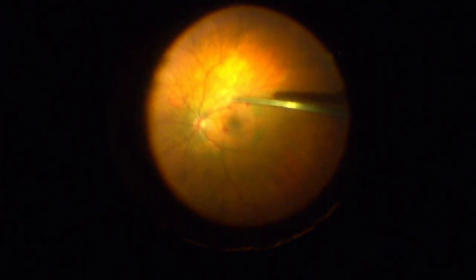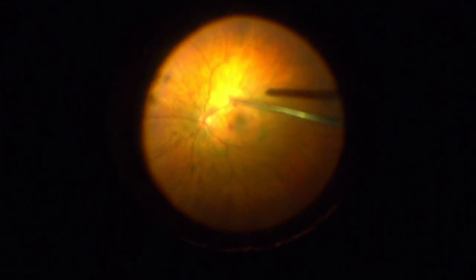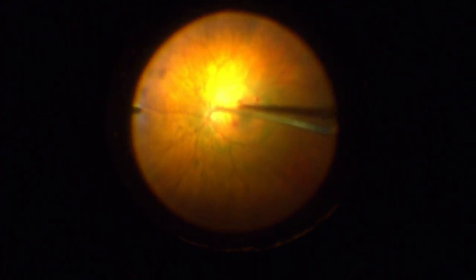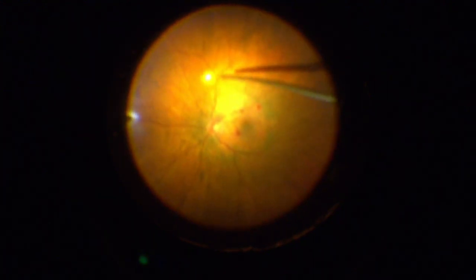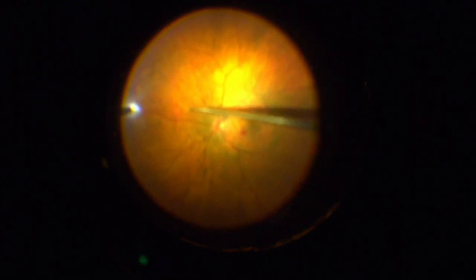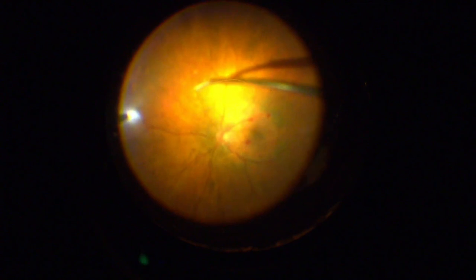And of course, I need the laser pedal by my left foot. So I'll wait for the circulator or someone to get that for me. Thank you. And I've learned through experience not to reach out with my foot and fall off my chair. Yeah, make Jenny catch me. It's happened before. And so now I ask for help to get the pedal in the right place.